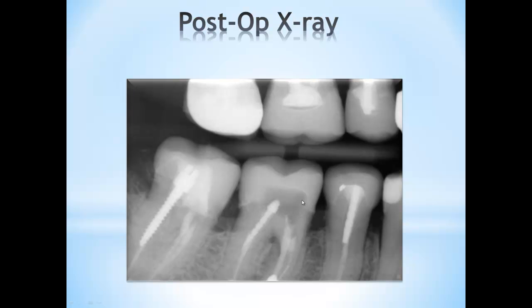You can see the final X-ray. You see the margins perfectly fit. There are no open margins. You can see those old restorations where I had placed the E.max on number 3, number 4. The patient is happy, and I'm going to post some pictures after 3 weeks when the patient has healed up.